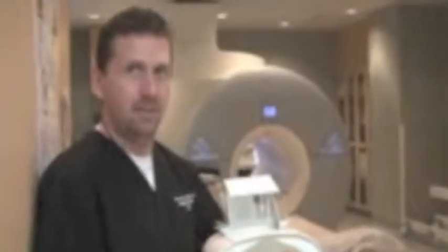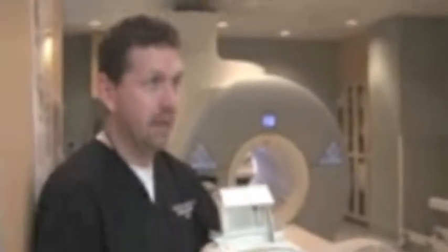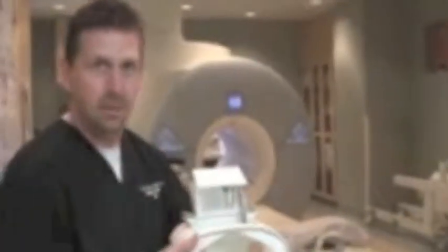So basically, everything we do is based off of water, since the body is mainly made up of 90% water or more. So the one thing we really don't look at in MRI is the lungs, because there's no water in the lungs, it's all air, so we're not able to visualize anything within the lung itself. But we can actually visualize any other part of the body that you can name, from toes to breast to head to fingers, you name it, we can image it somewhere or another, heart.